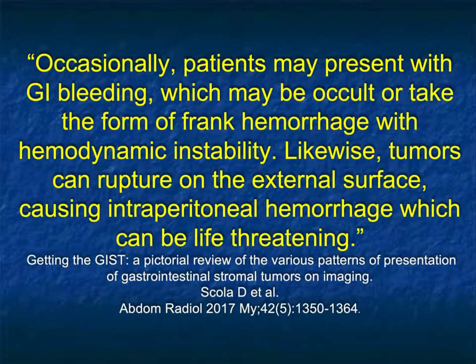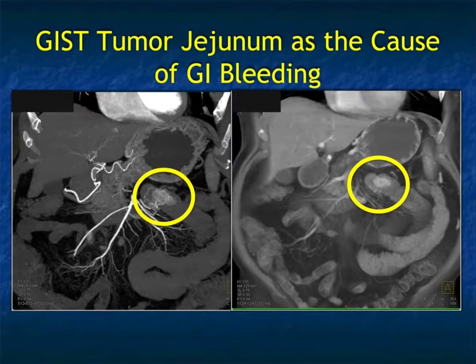Occasionally, patients may present with GI bleeding. Again, occult versus frank hemorrhage. So we always need to look at the bowel carefully for those possibilities.